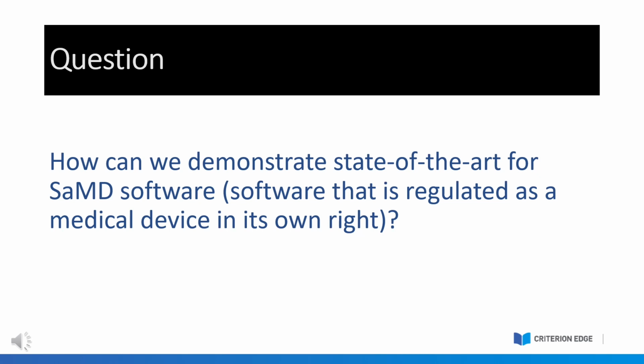That's the key there, same intended medical purpose. So even if you feel like it's configured differently, a totally different type of approach to the software, totally different mode of action, if it's trying to treat the same clinical condition or diagnose the same clinical condition, then it would be considered a comparator software because of the functionality.